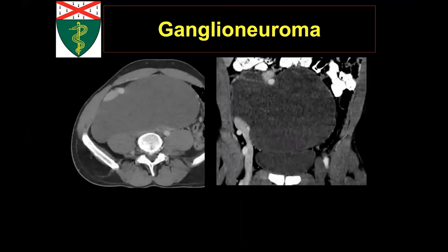This was an unusual case of a ganglioneuroma that I'll just share with you, but it has quite atypical features. A large mass looks actually quite low in its density. It's displacing the right iliac vasculature anteriorly. It's squeezing the left internal iliac vein over here. If you look at it on the coronals, we can see the right external iliac vein looks patent, and the left one is actually thrombosed. So this was a large ganglioneuroma with mass effect causing a thrombus in the left lower extremity.